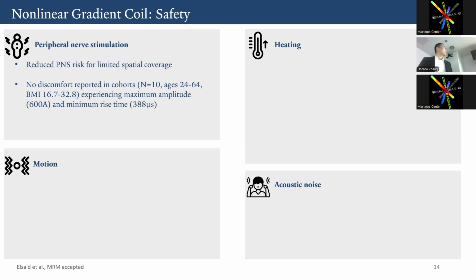First, PNS. Because of the limited spatial coverage, it has reduced PNS risk. And for the cohorts that we tested, there has been no discomfort reported, even with the maximum amplitude and the minimum rise time.